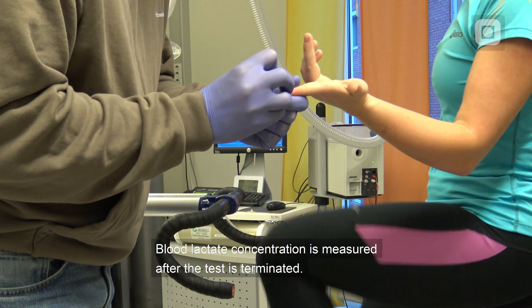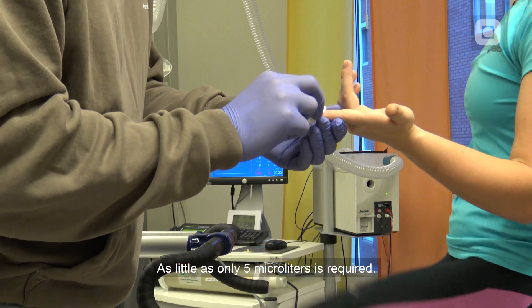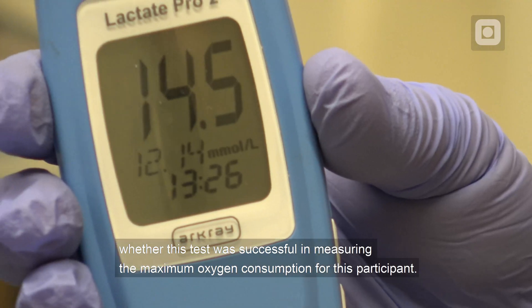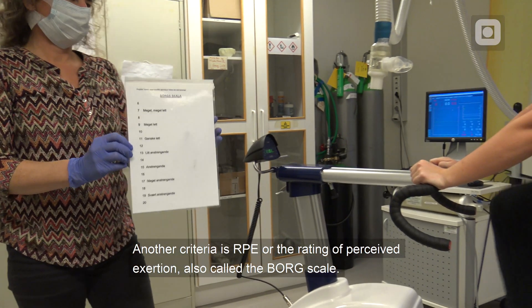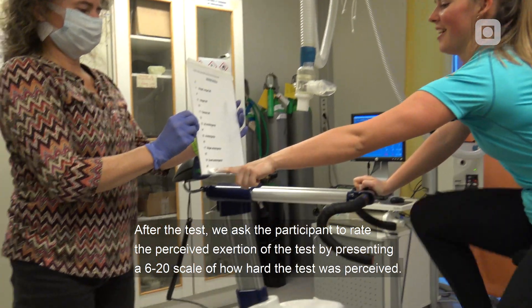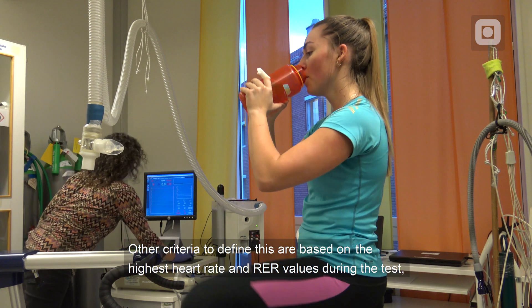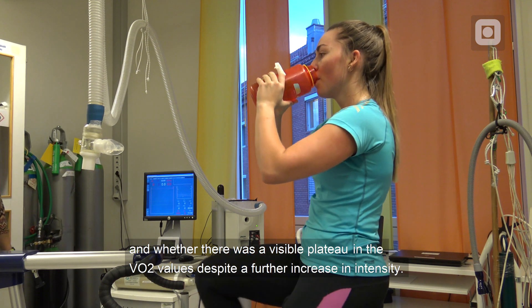Blood lactate concentration is measured after the test is terminated, by collecting a small blood sample from the fingertip — as little as only 5 µL is required. Blood lactate concentration is one of the criteria that can tell us whether this test successfully measured the maximum oxygen consumption. Another criterion is RPE, or the rating of perceived exertion, also often called the Borg scale. After the test, we ask the participant to rate the perceived exertion using a 6-20 scale. We use these additional measurements to decide whether we can call the highest VO2 obtained truly VO2max. Other criteria include the highest heart rate and RER values during the test, and whether there was a visible plateau in VO2 values despite a further increase in intensity.